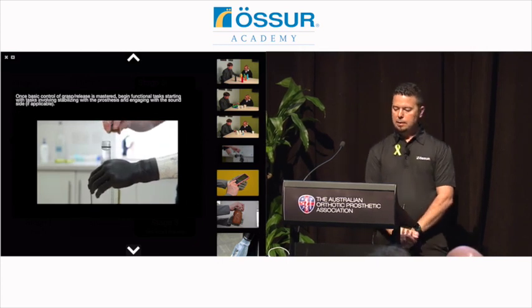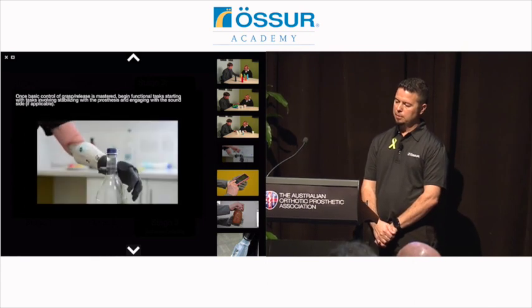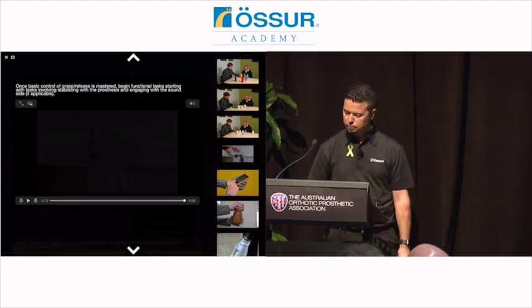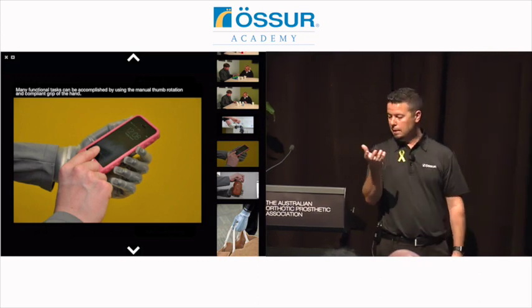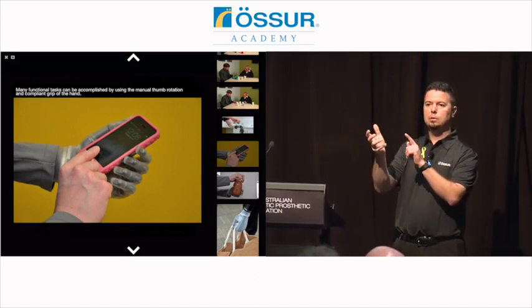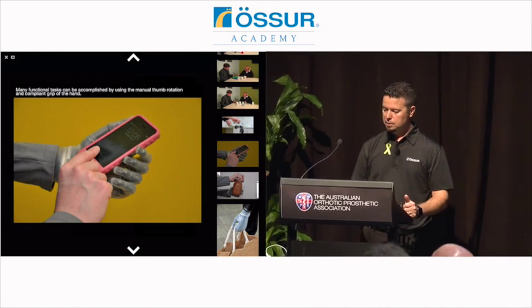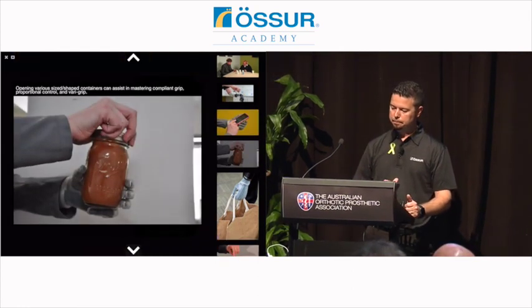Here's some VariGrip examples. It's time to party. You're opening up your vodka bottle. You want to make sure that you can get a good grip around it as you twist that top off. Another big one is holding a phone. That compliant grip is really helpful for that. It's going to conform to the shape of your phone so that they can use the hand, or you could use the touchscreen to activate the phone as well. But that's a big one. You can show them in stage 1 how those fingers will conform or comply to the shape of the phone.